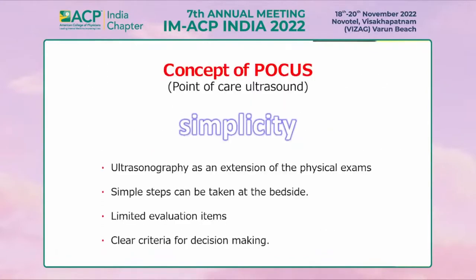The concept of POCUS is simplicity. POCUS is ultrasonography as an extension of the physical exam, like a stethoscope. Limiting the number of evaluation items and clarifying evaluation criteria are key points of POCUS. It's to reduce learning difficulty and maintain test quality.